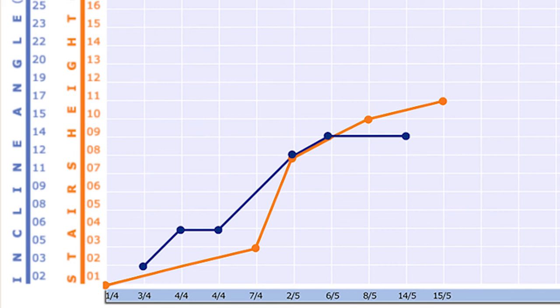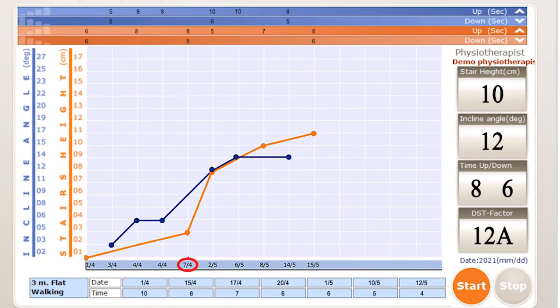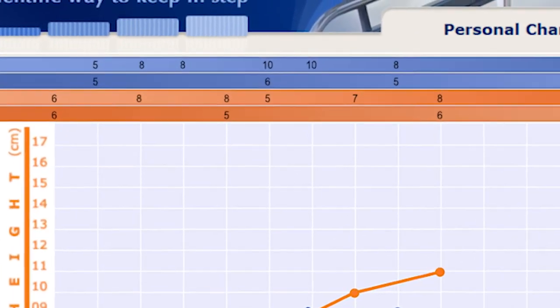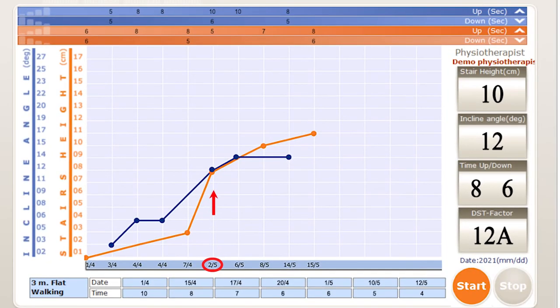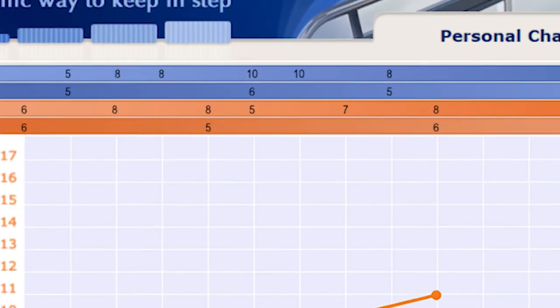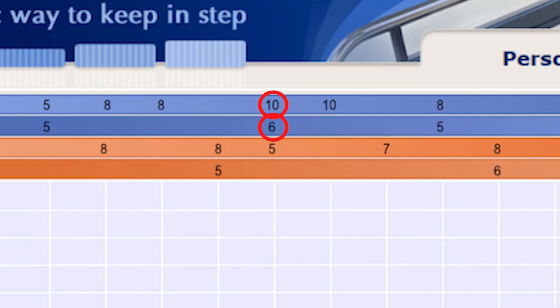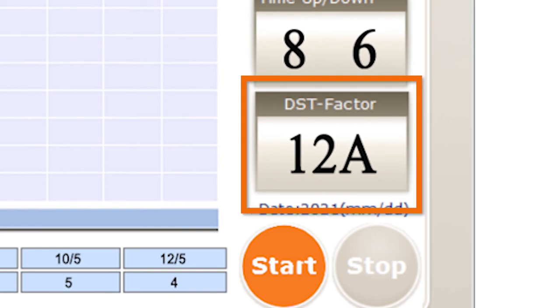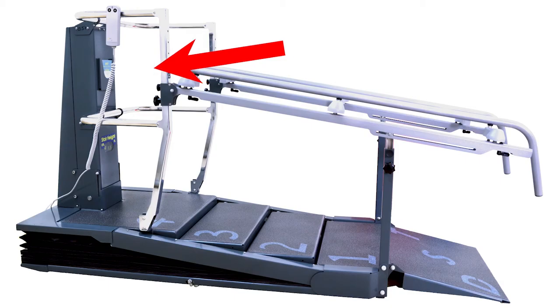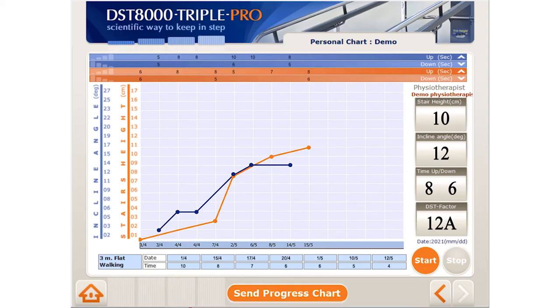The orange graph represents stair practice, while the blue graph represents slope practice. For example, on April 7th, the patient climbed stairs of 3 cm. Above, you can see the time it took the patient to go up and down the stairs. On May 2nd, the patient climbed a slope of 12 degrees, and it took 10 seconds to go up and 6 seconds to go down. After 5 sessions, the system will automatically produce the DST factor — a unique parameter summarizing the patient's current status and estimated future improvement potential. For more information on the DST factor, please see the user guide or visit our website.